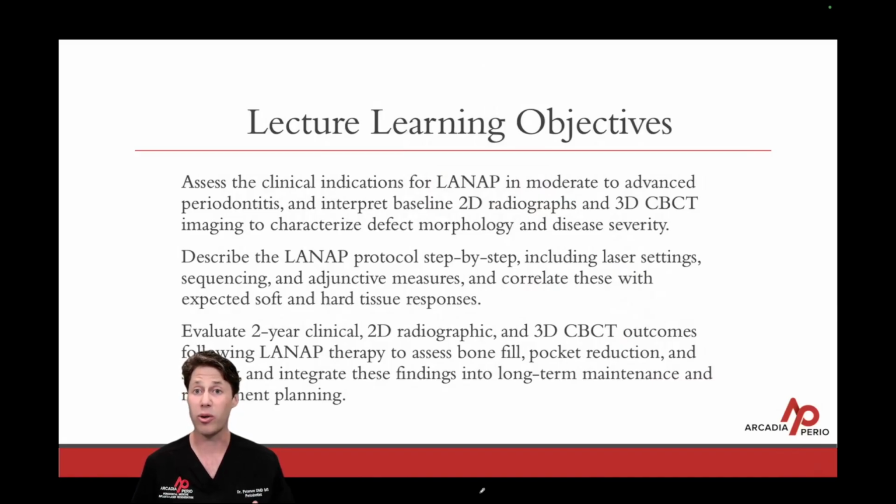I want you to be able to describe the LANAP protocol step by step. I want you to be able to describe it in your own words so you can tell the patients what's going to happen when they come and see me to get their periodontitis treated. I want you to understand everything step by step, including the laser settings, the sequencing, and any adjunctive measures that correlate to expectations in hard and soft tissue changes.